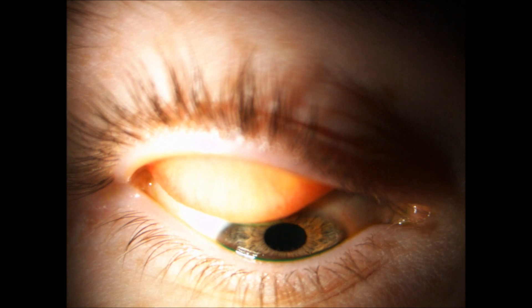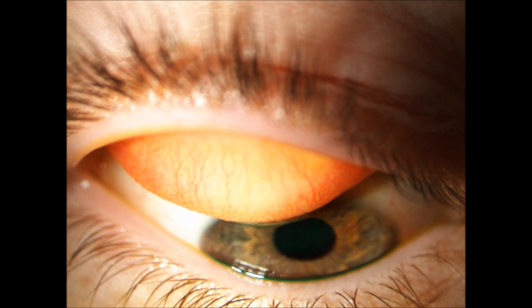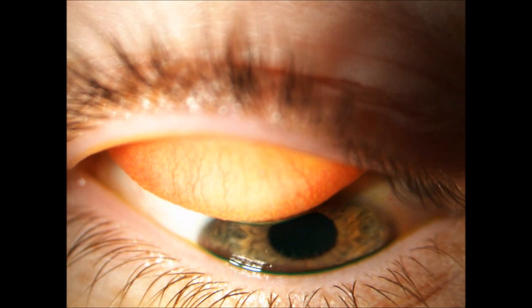So we have a look there — we can increase the mag and this will let us see the redness a lot better. So focusing in here, I can see the lid redness. We'll record that on the record sheet just using the appropriate grade and scale — CCLRU or Efron, depending on what you want. Now we'll put the blue light on just to assess the lid roughness. If we increase the mag again and focus it in, there we are — we can see the staining that the fluorescein gives you on the lid. That's really what we want to assess.